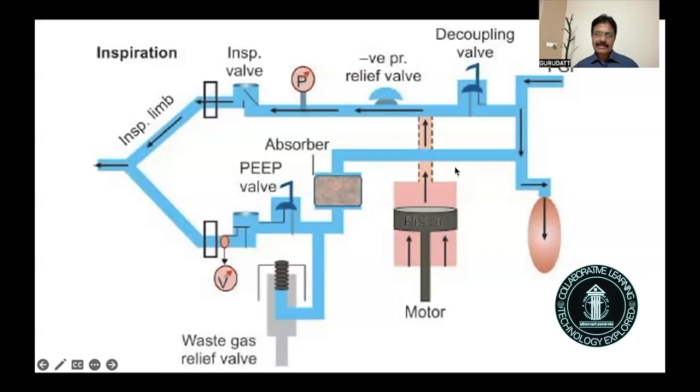In the meantime, the expired gases which are passing through the absorber are also coming and entering into the bag, and the bag is inflated. So here you can see the fresh gas flow is totally disconnected from the patient during inspiration.